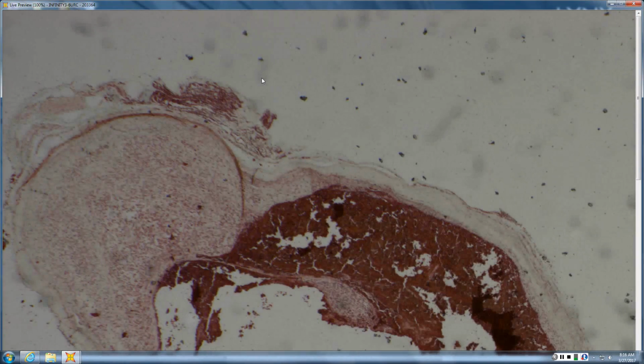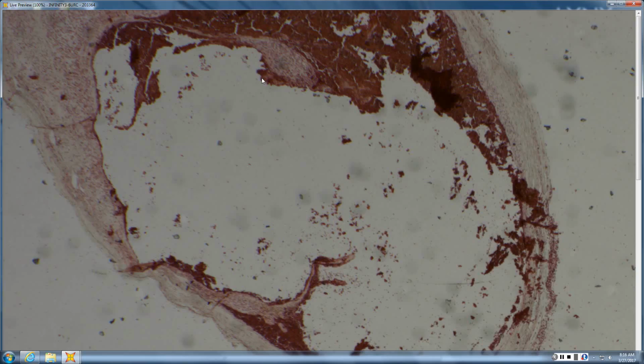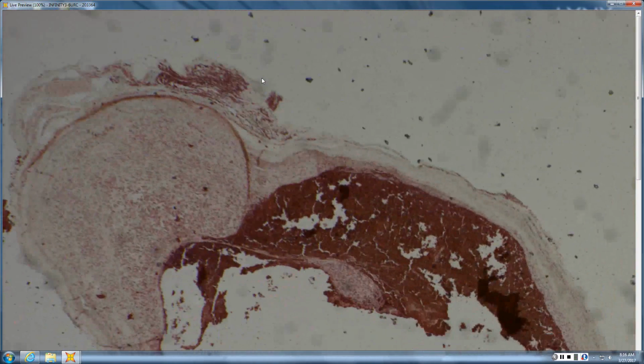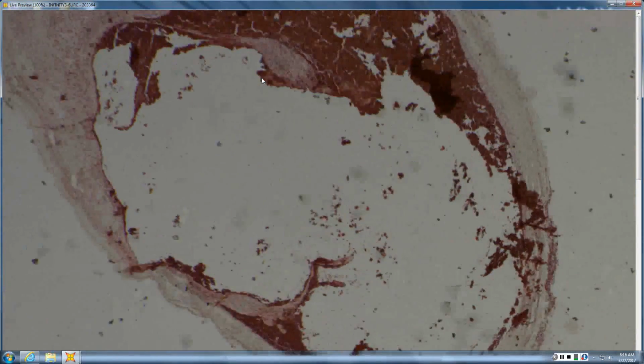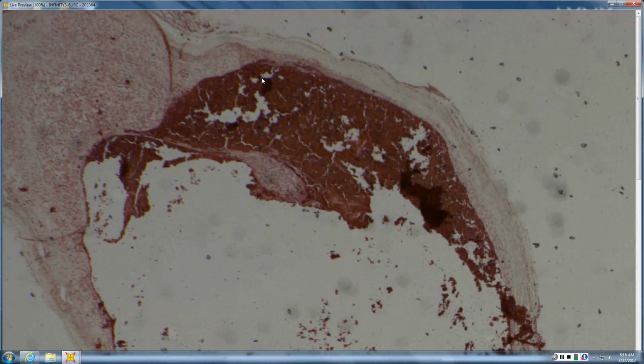A lot of hemorrhage into it. And what's its overall shape? It looks like it's one or maybe two large fascicles. Yeah. The whole thing may be round to pretty long oval. Encapsulated or non-encapsulated? Looks like it's got a little capsule, and just a little hint of subcapsular edema.